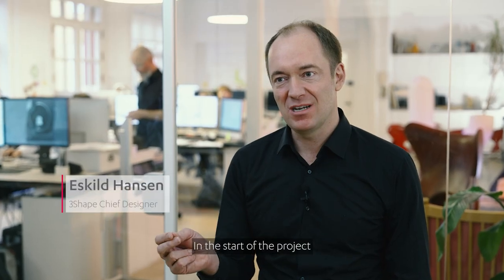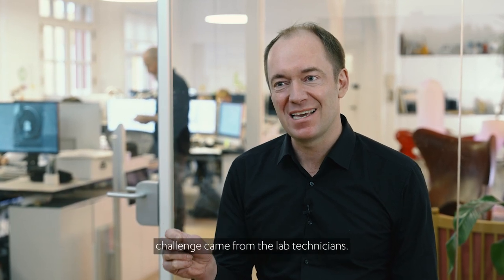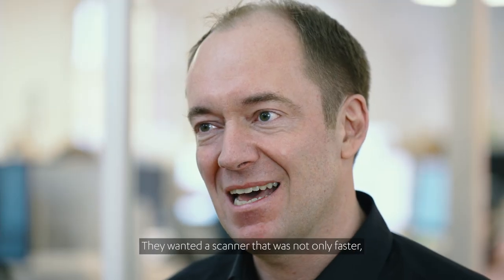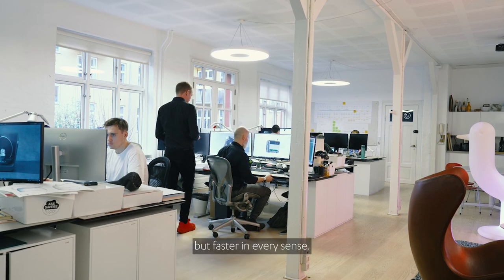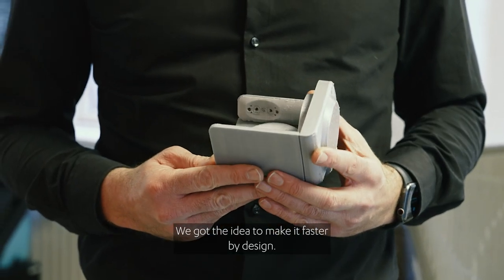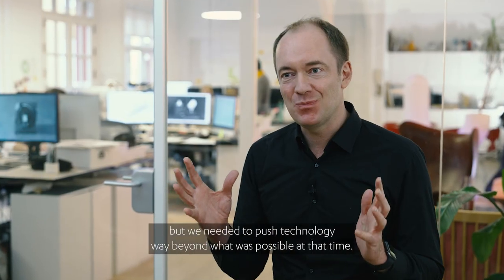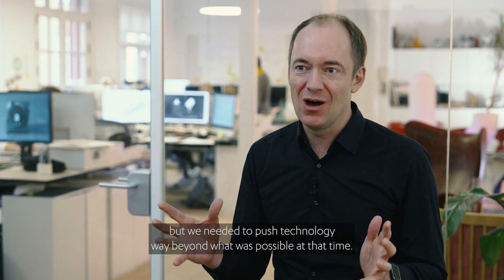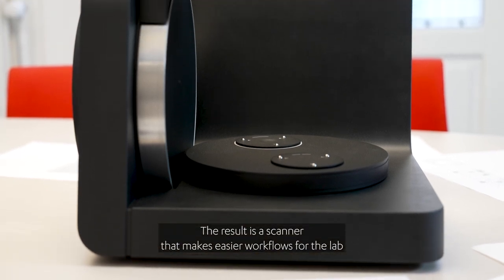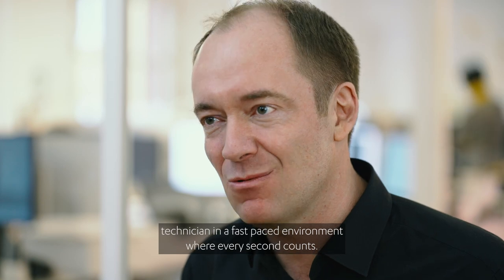At the start of the project, we travelled the world visiting labs. And here a new design challenge came from the lab technicians. They wanted a scanner that was not only faster, but faster in every sense. We got the idea to make it faster by design. We fell in love with this beautiful open design, but we needed to push technology way beyond what was possible at that time. The result is a scanner that makes easier workflows for the lab technician in a fast-paced environment where every second counts.